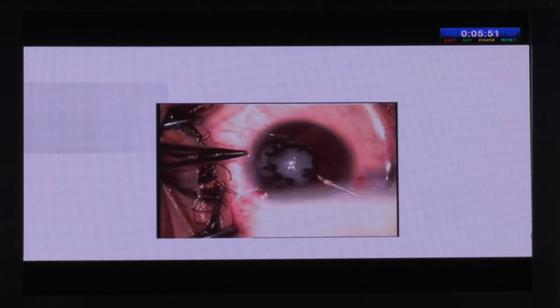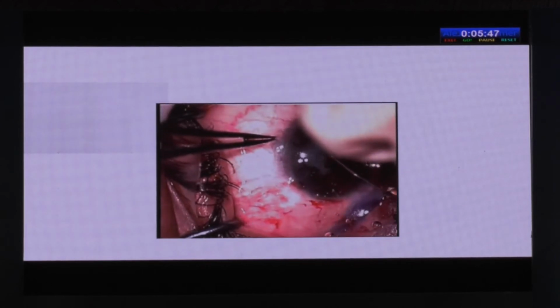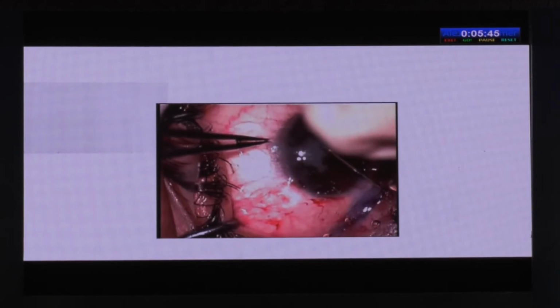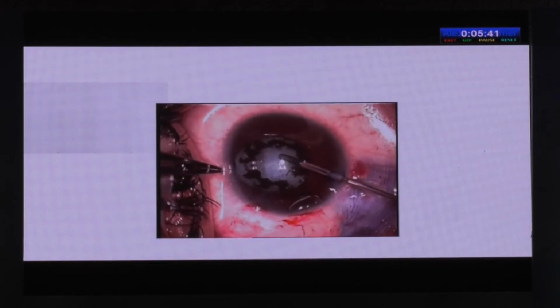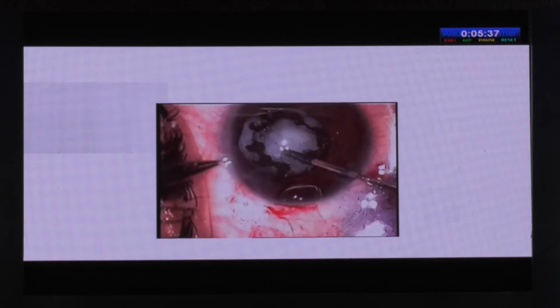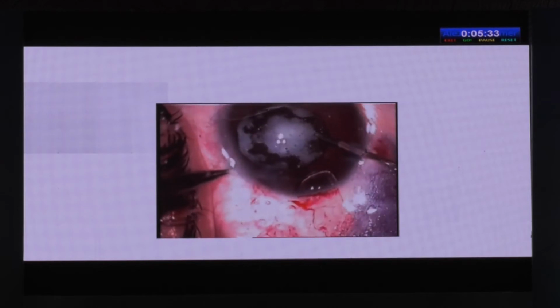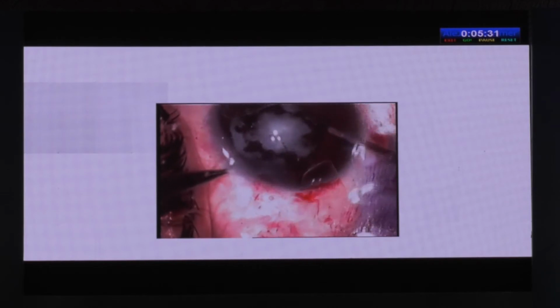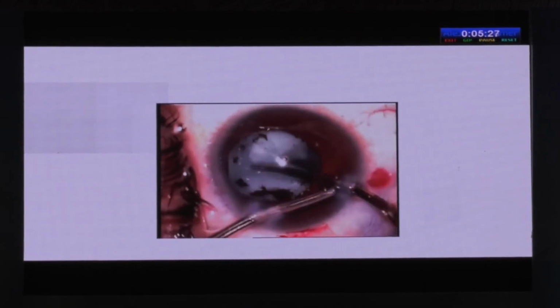So whether this patient had also had vitreous opacities, the question was whether one should do a combined vitrectomy with it. I plan to do a separate one. Now this patient is almost 2 years on treatment, has 6/18 vision and 6/6 vision, and still has vitreous membranes. So sometimes you feel the need for a vitrectomy also.